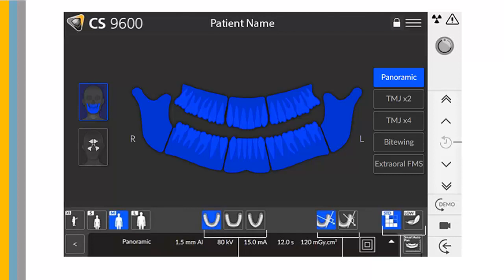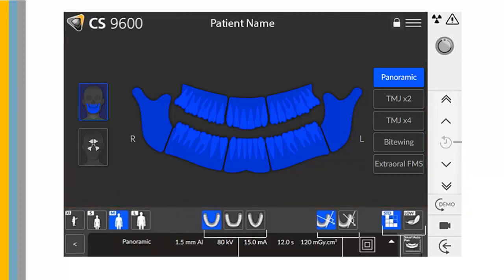Touchscreen Control Panel Functions: The Program Pane and Preview Screen displays the choice of programs and enables you to choose different radiological exams according to the unit edition you have. Options include Patient Type — Small, Medium, or Large Adult — Dental Arch Morphology, Type of Trajectory (Standard or Orthogonal), and Options (Standard or Low Dose Imaging Mode). This pane also exits the acquisition interface.